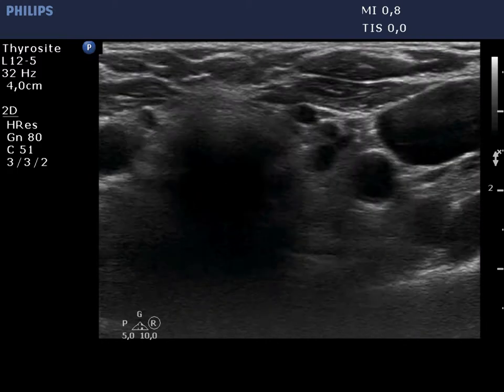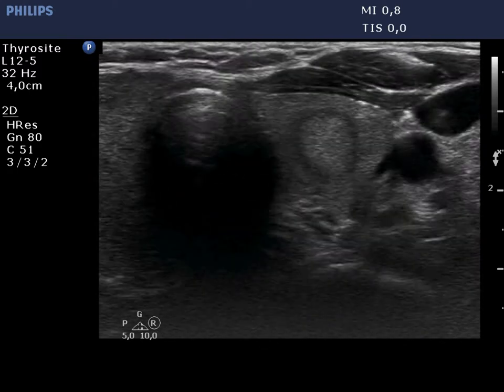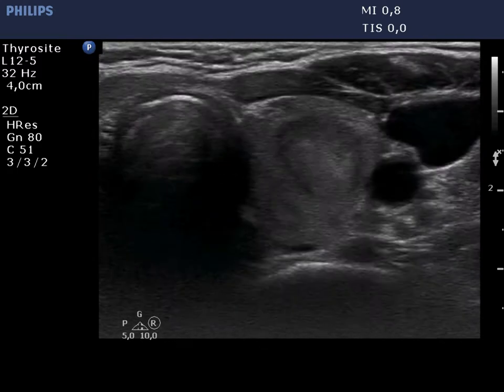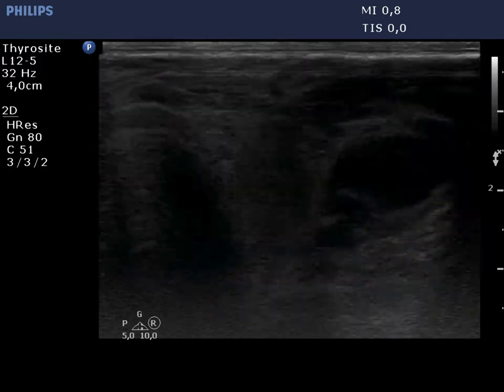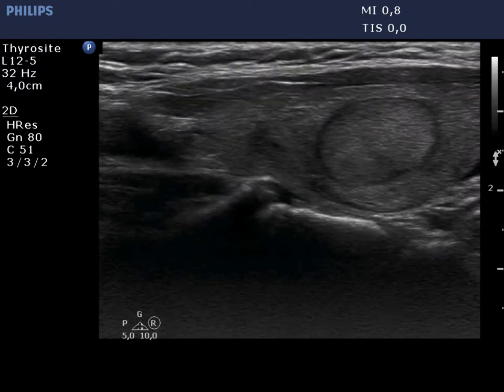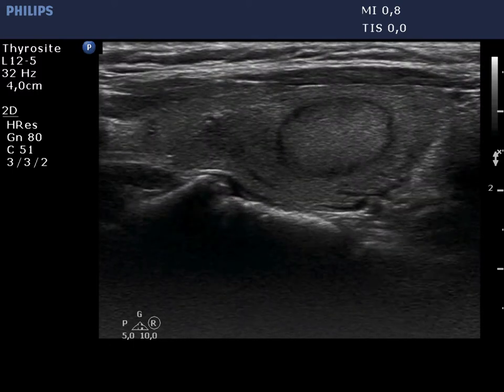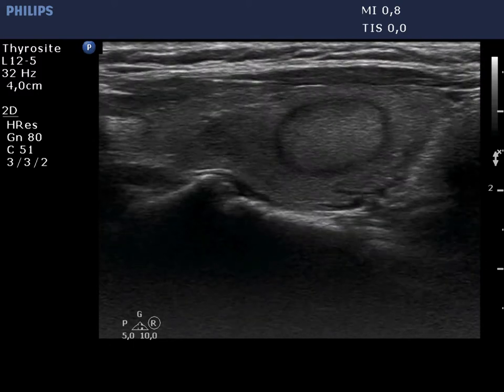The left lobe has a similar appearance. There is an isoechoic nodule in the central part of the lobe. The lesion has a regular, geometrical shape and presents a halo.